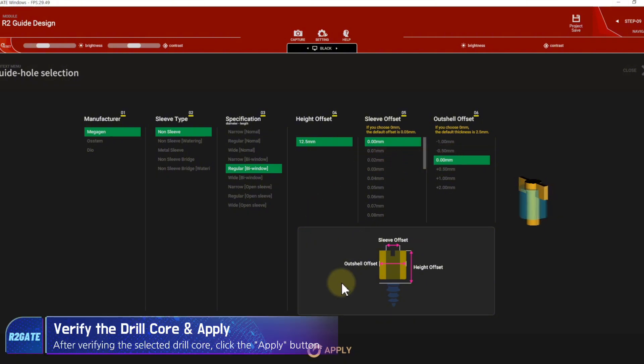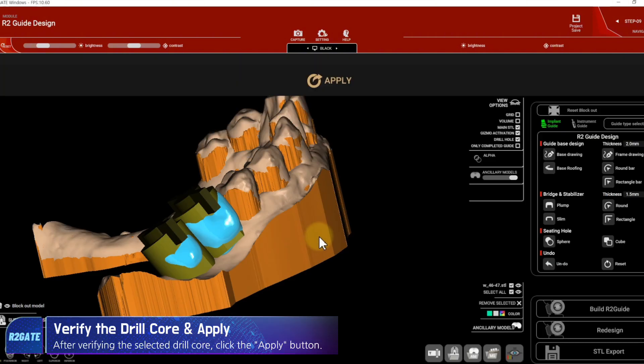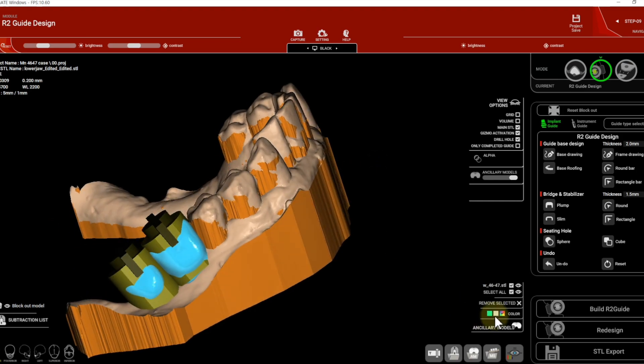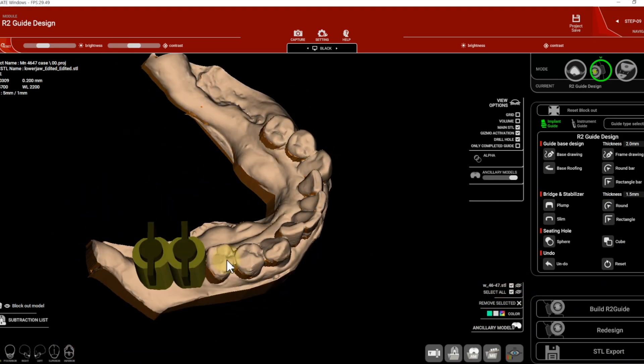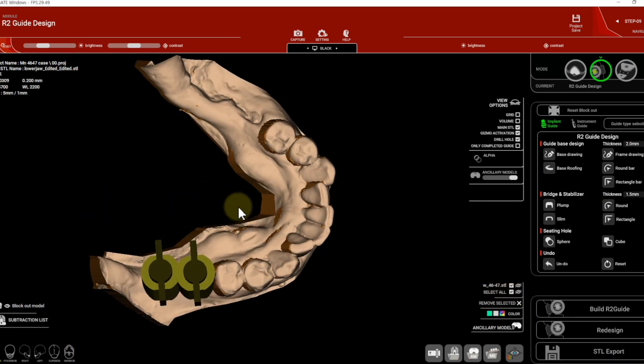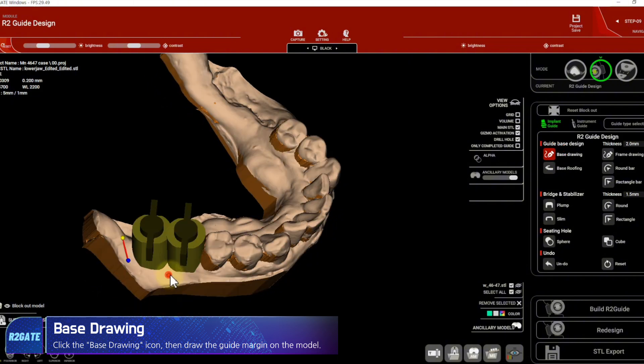After verifying the selected drill core, please click Apply. Click the base drawing icon, then draw the guide margin on the model.